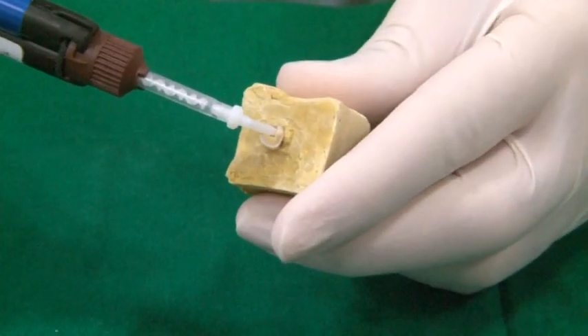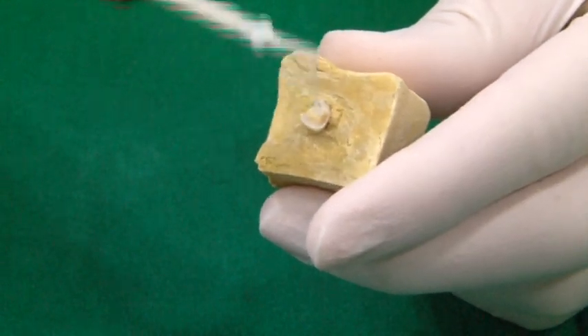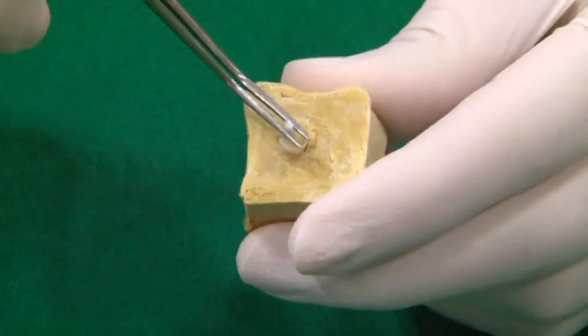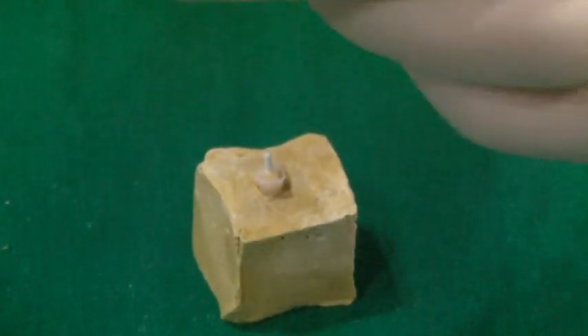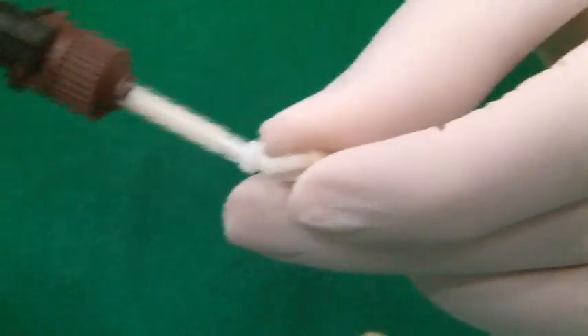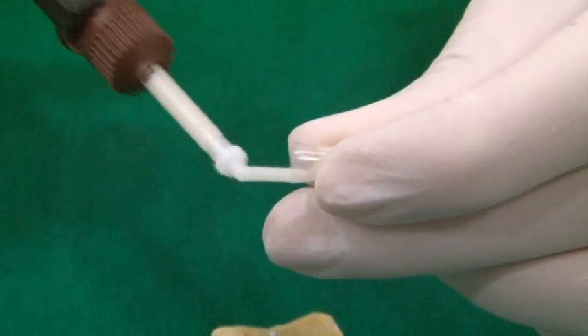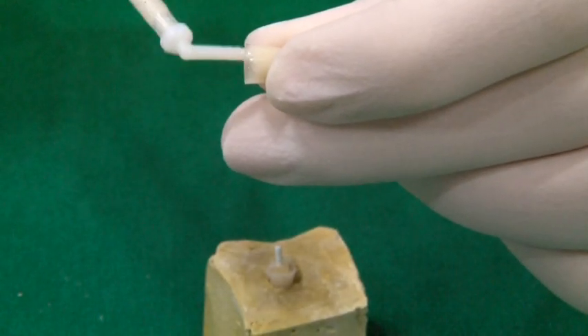Luxa core is now injected in the canal space and the post is placed. This is followed by injecting Luxa core in the core former. This core former is now placed on the tooth and light cured for 20 seconds.